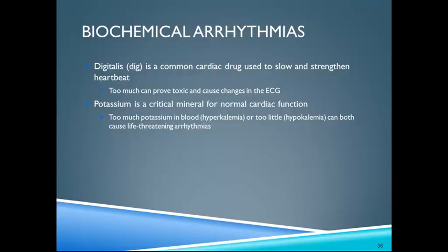Potassium is a critical mineral for normal cardiac function. Too much potassium, or hyperkalemia, or too little, or hypokalemia, can cause life-threatening arrhythmias and can be seen on EKG. Usually there is a dip right before the T wave, or a slightly abnormal elevated T wave.